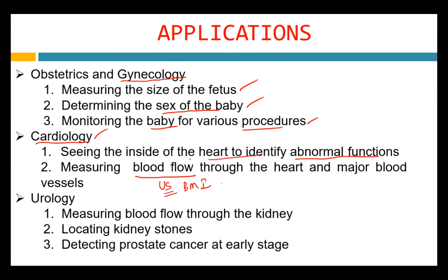Ask them to show it. And third is urology. This is where I was inducted 15 days back. It was a very tough process. It is used to measure blood flow through a kidney and to locate kidney stones, exactly where they are present and the size of the stone. I have a 4 mm stone in one kidney and 5 mm in the other. So the exact location and diameter of a stone is also possible; ultrasound can measure and tell you.